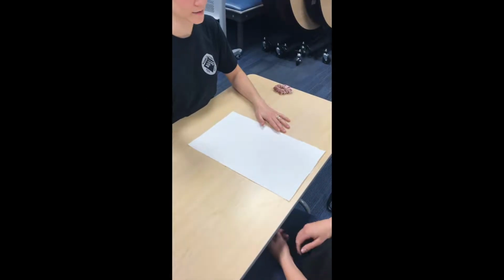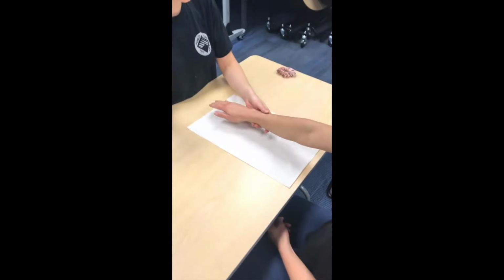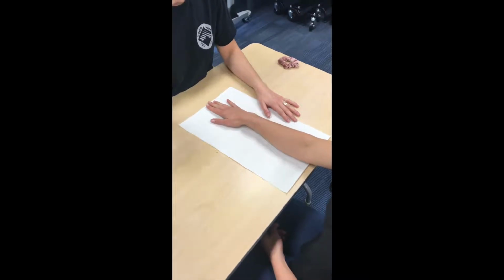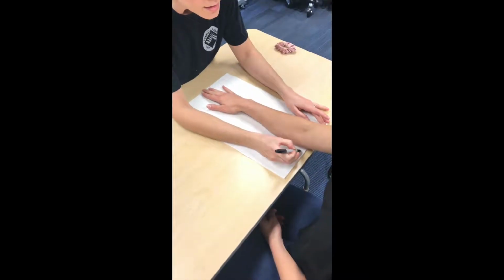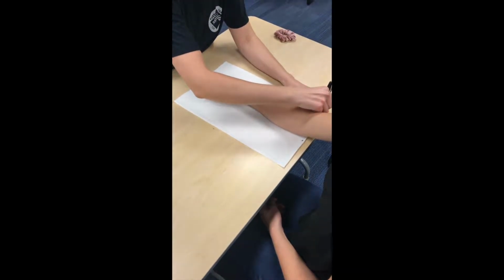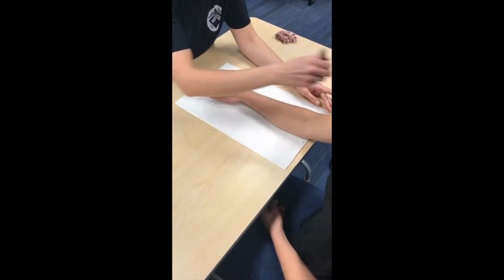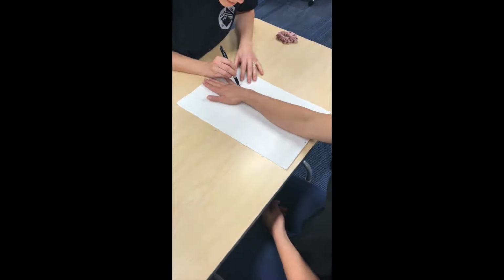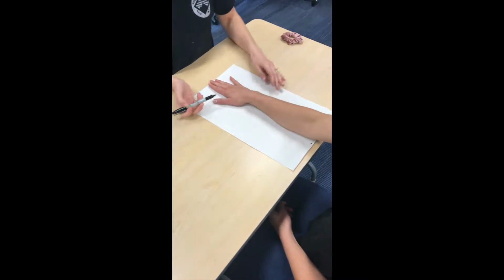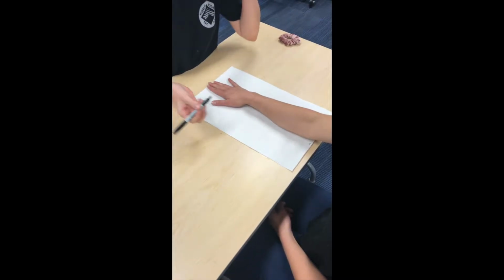Show you how to make the pattern for the Muenster Orthosis. So go ahead and put your client's hand on a piece of paper towel, and then we're going to be marking just near the elbow right here, and that'll be the end of the Muenster. And then make another mark just proximal to the 5th metacarpal as well as the 2nd metacarpal, and that's going to be associated with her distal palmar crease.